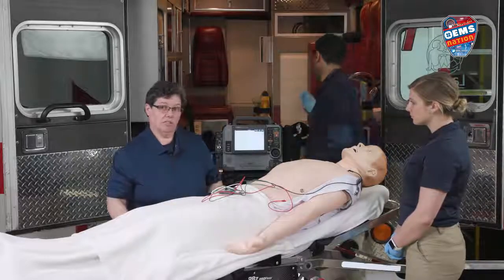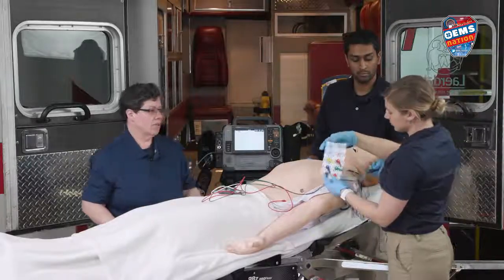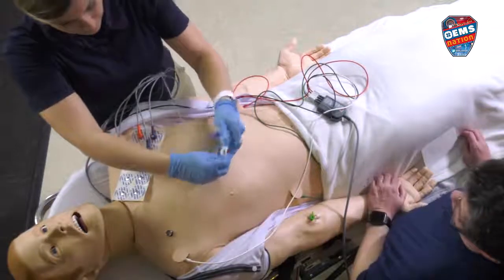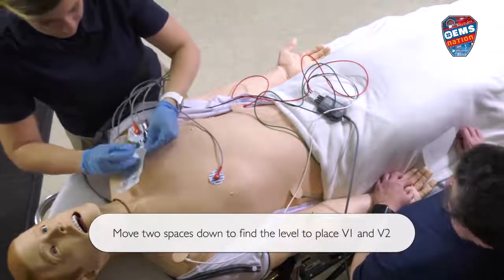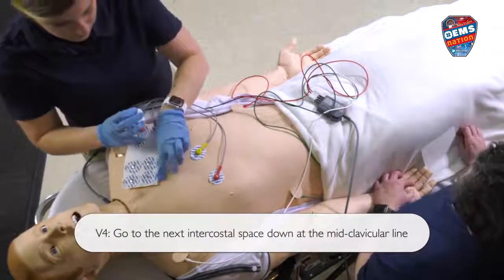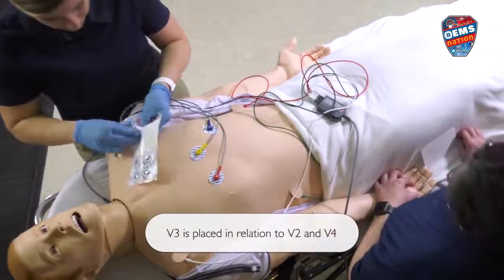We're going to put the V-leads, or the chest leads, on now. They're labeled V1 through V6. We're going to start by putting V1 at the fourth intercostal space on the right side of the sternum — the patient's right side. Then we're going to put V2 on the other side of the sternum. Next, we're going to place V4 at the fifth intercostal space at the mid-clavicular line — that means the middle of the clavicle. Then V3 goes between V2 and V4.